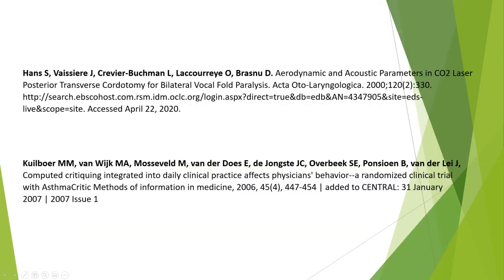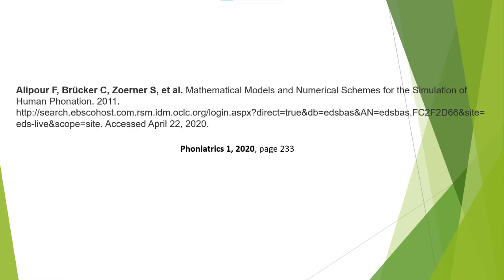In the first study, aerodynamic parameters were measured with Aerophone 2. They included peak flow, and they could document that the laryngeal aerodynamic parameters can be used objectively to follow patients longitudinally after operation. In the second study, the question that is underlined in this paper is of interest. The conclusion is that the results are dependent on the circumstances under which the physician is monitoring.